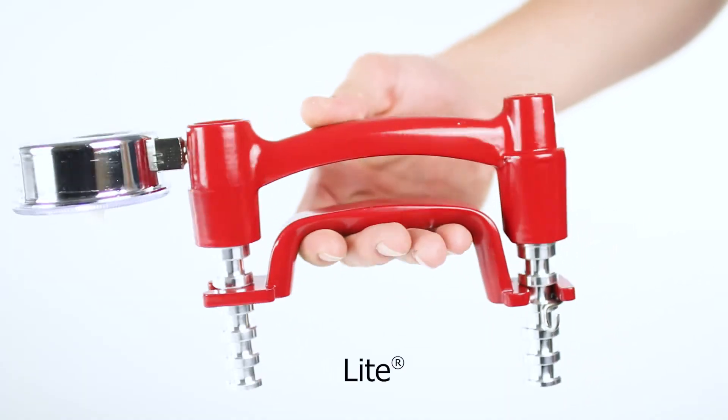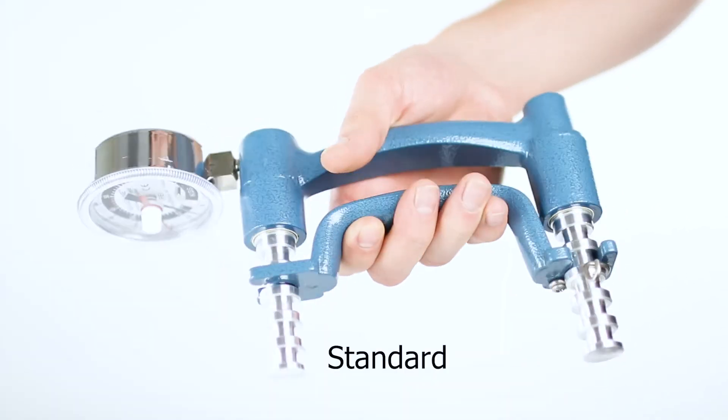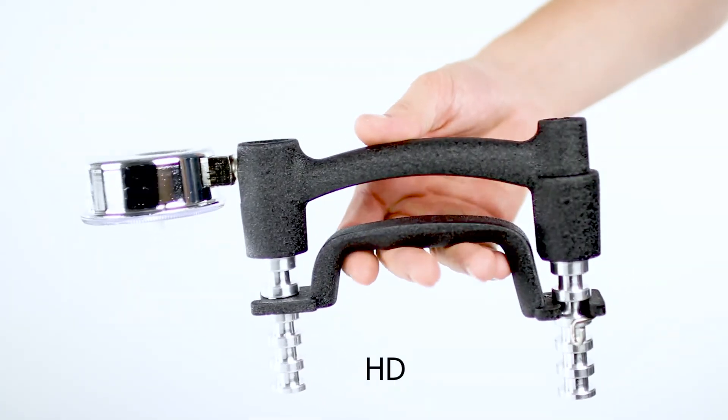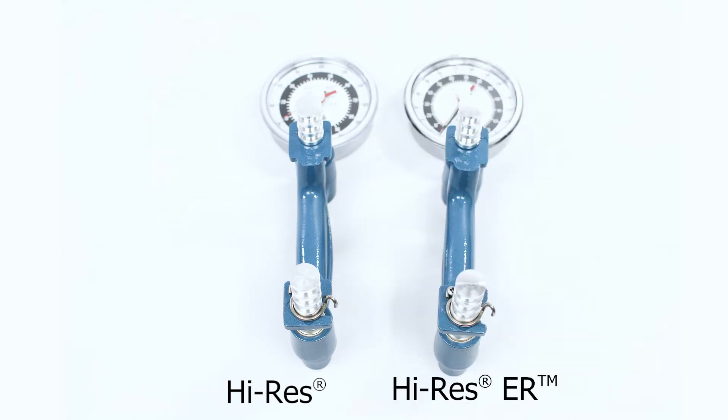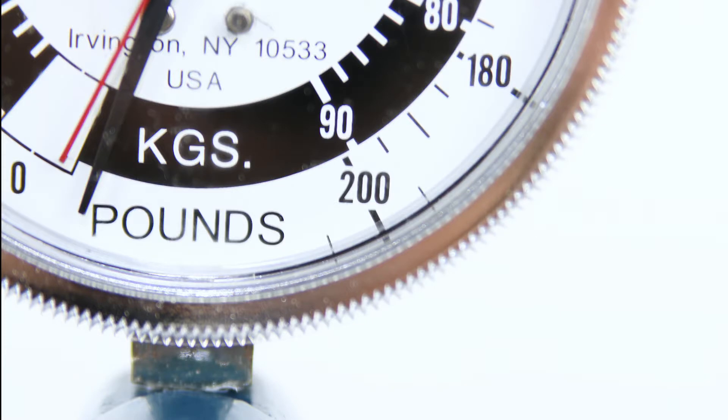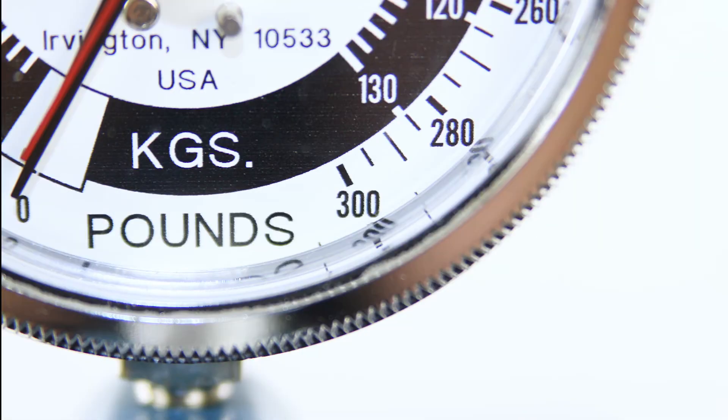The light comes with a 1 year warranty. The HD comes with a 5 year warranty. The Hi-Res and the Hi-Res ER are both designed with a larger 3.5 inch gauge. The Hi-Res has a 200 pound capacity. The Hi-Res ER has an extended maximum capacity of 300 pounds or 136 kilograms for athletes.